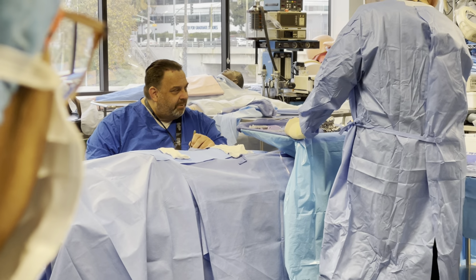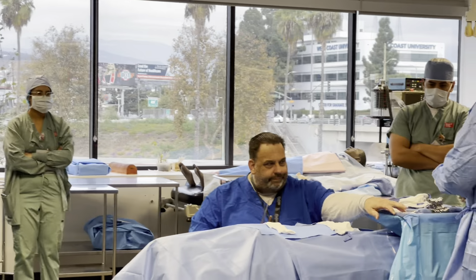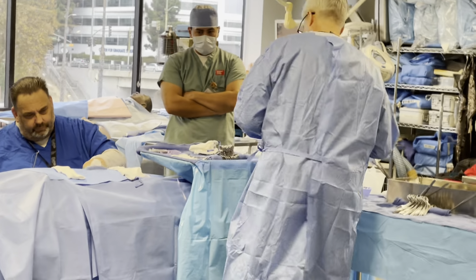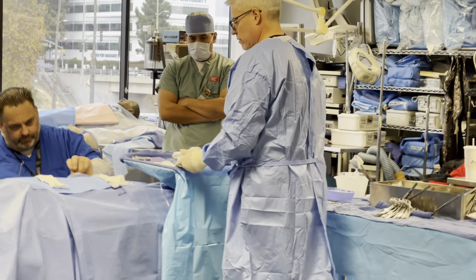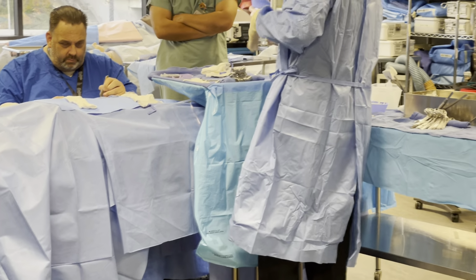Now, why do you think we don't want to put our dressings in the field until this point? Because they could get contaminated with anything. Contaminated? What's the difference between these two? Oh, mixed up with latex. What's the difference? You see a blue stripe on it? No. You flip it over. So if I have my dressings right next to my laps, and my surgeon reaches over, and I turn my back, I come back over, it's now lost. I guarantee you the second that goes in the cavity, it is lost because it soaks up blood and looks just like every other structure in there. You will not find that.